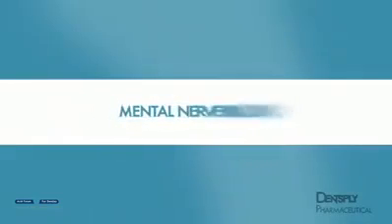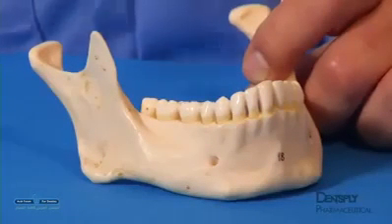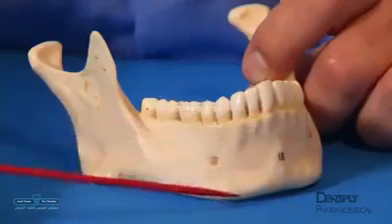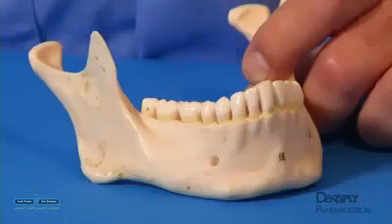Mental nerve block. The mental nerve may be anesthetized for procedures involving the chin and lower lip, the buccal mucosa and mucoperiosteum from the premolars to the midline, or to supplement an incomplete inferior alveolar nerve block.